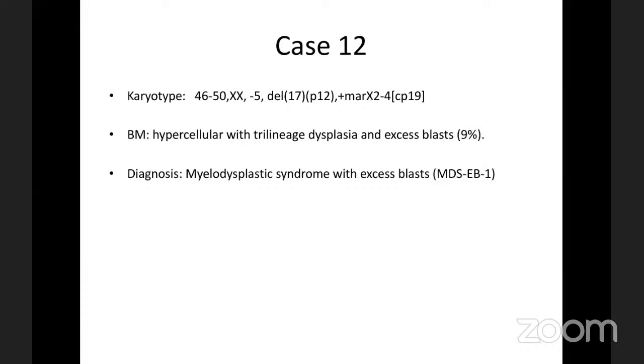So, as I told you, in the cases of MDS, peripheral blood morphology is helpful, yes, as a baseline. Before you do the bone marrow, you need to rule out that this is not due to nutritional deficiencies or drug induced or presence of infection or related immunological diseases that cause the pancytopenia or the cytopenia. So peripheral blood is helpful, but not always, and the decision will be kept for the bone marrow.